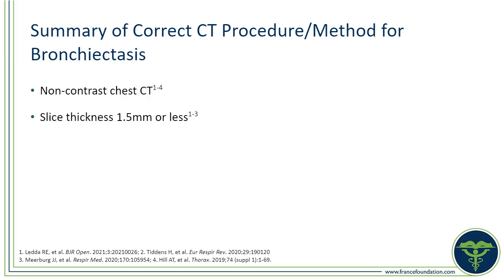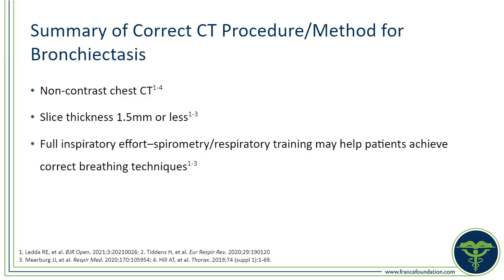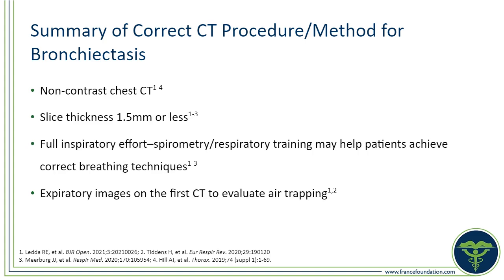We're going to ask the patient to take a full inspiratory effort, and expiratory images also require instruction from the technologist so the patient breathes out completely to evaluate for air trapping.